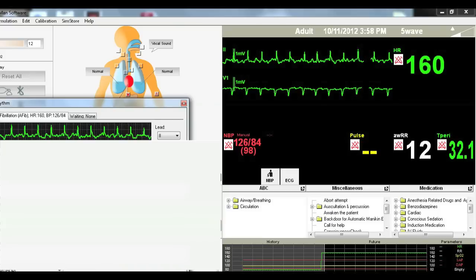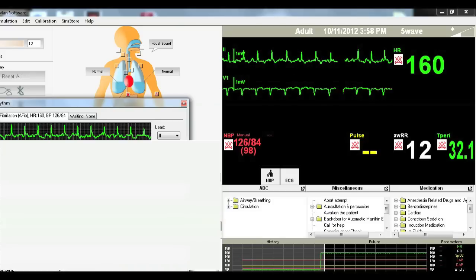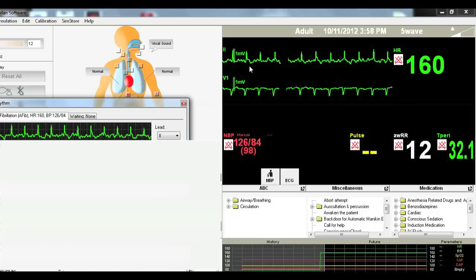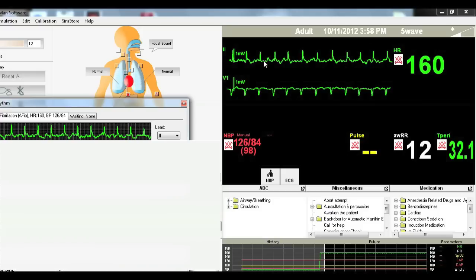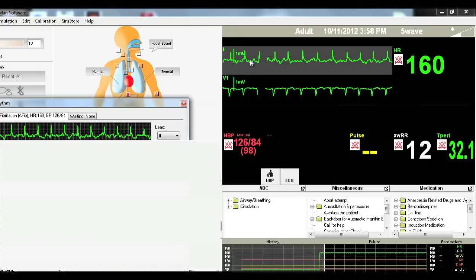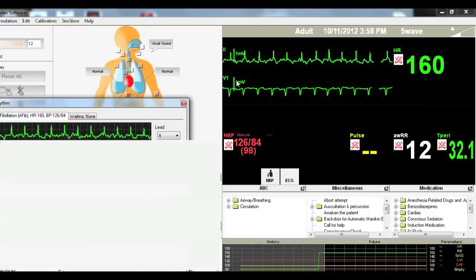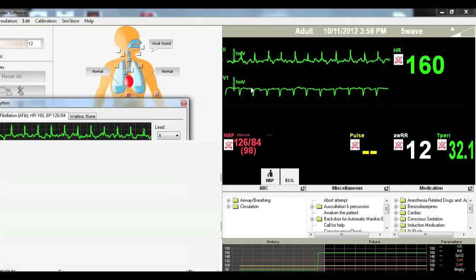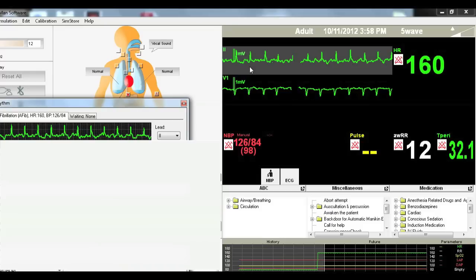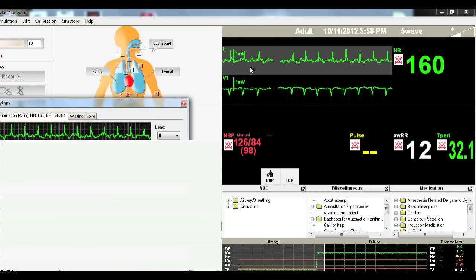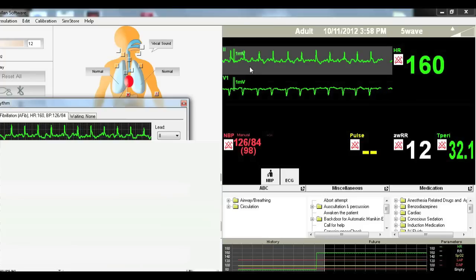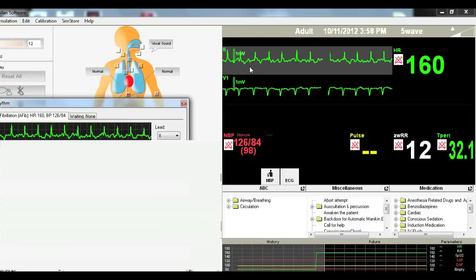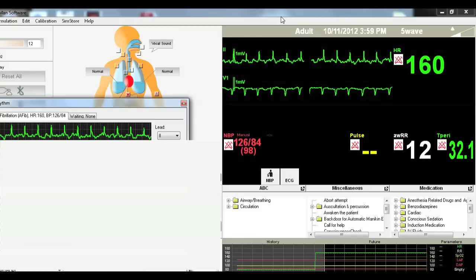This is an AFib, typical atrial fibrillation. This is characterized by this rapid fibrillation or rapid electrical activity that is occurring between the QRS complexes. Typically you are going to have a high heart rate and a fast heart rate. This is due to the atria fibrillating or fidgeting, twitching, rapidly twitching atria. So you are not going to have your atrial kick.